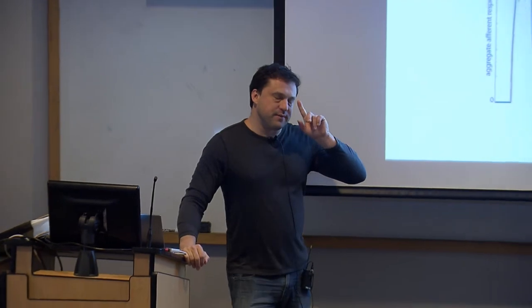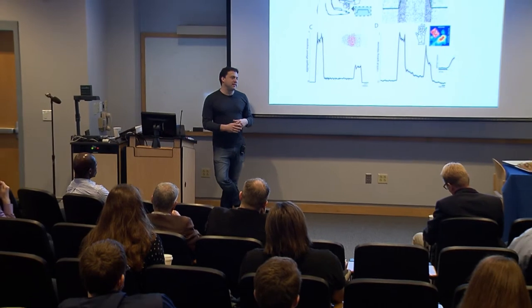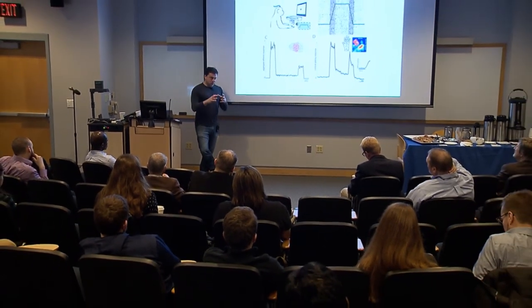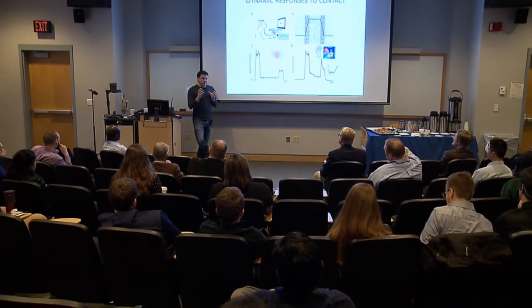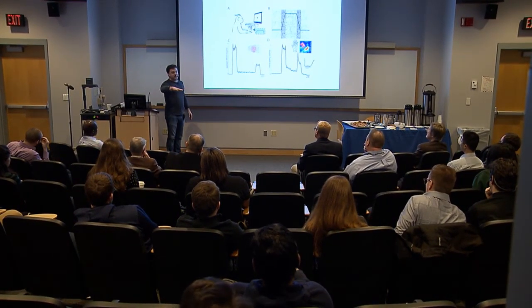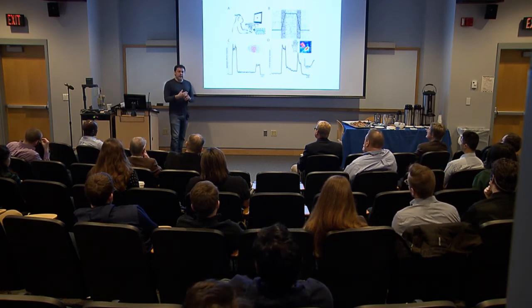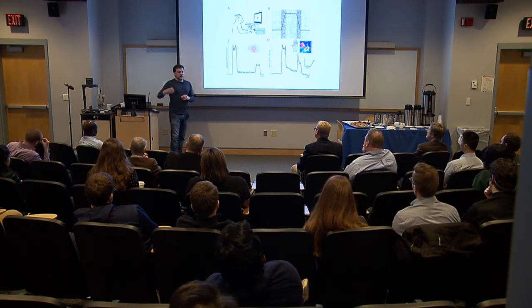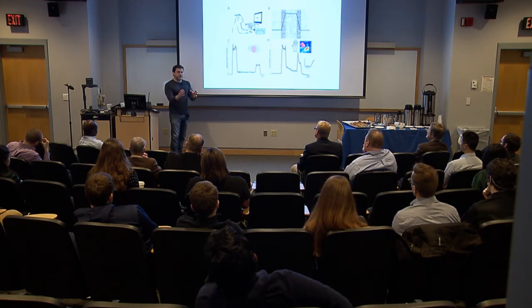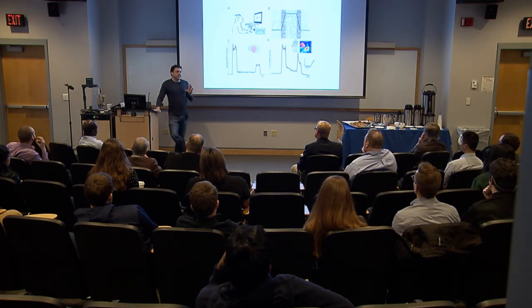But I just want to say one last thing: given the state of technology, there's no way we're going to, in the near future or maybe ever, be able to reproduce the sense of touch in all its glory. What we can hope to do is, respecting the somatotopy is a no-brainer, no pun intended. You do that or you're dumb. But also the dynamics: we see these dynamics are so consistent, so salient, that I think if we reproduce them, we'll have more useful signals. And in fact, there's some not yet convincing evidence that that's the case.